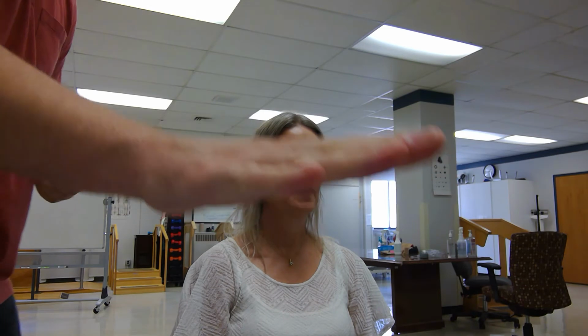So I can read DVOHC. Okay, try the next one. OHBCK. HZCKO. Okay. I can't read... And then the last. Okay, so she made it to line 9 on the eye chart.